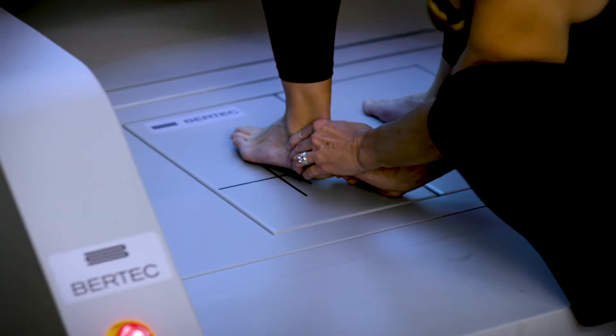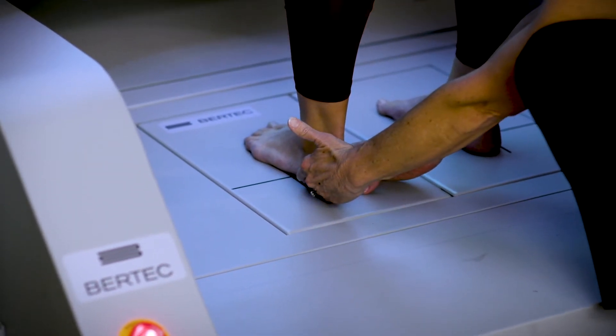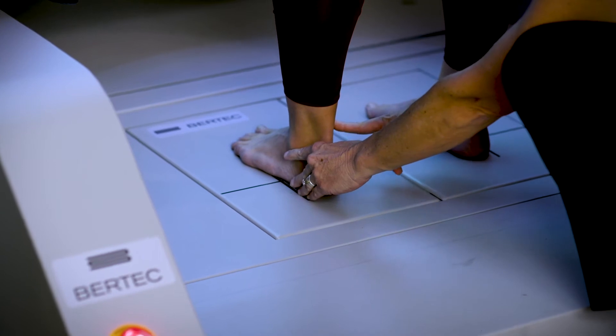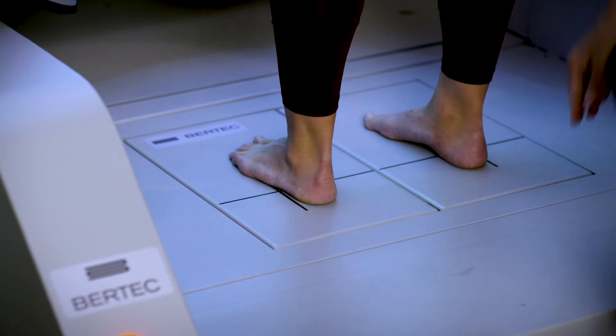Jackie lifts her left foot and I place it so her calcaneus is on the large vertical line and her medial malleolus is on the black horizontal line. She looks good right there.